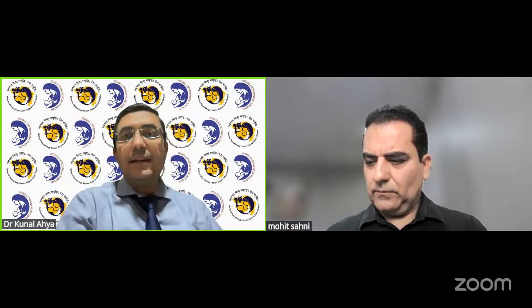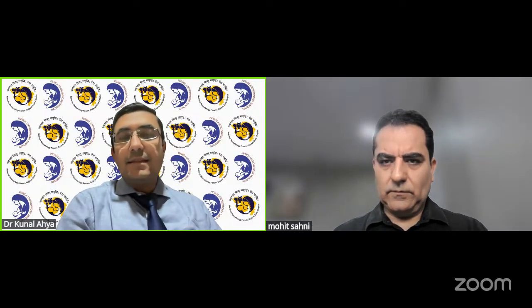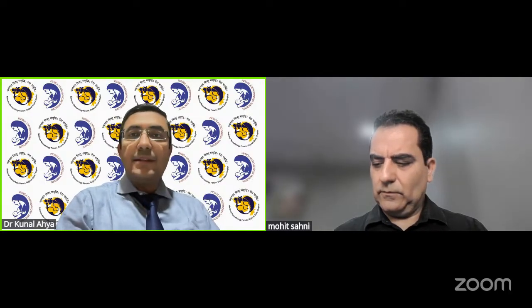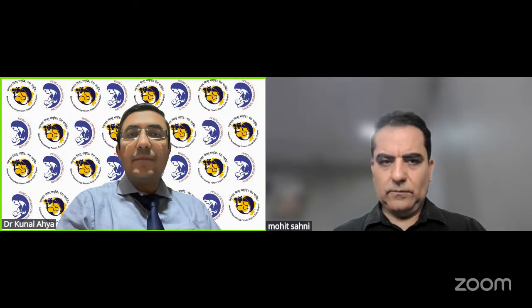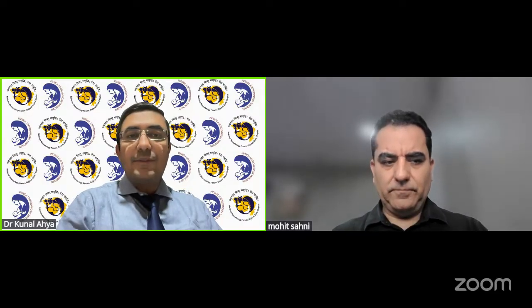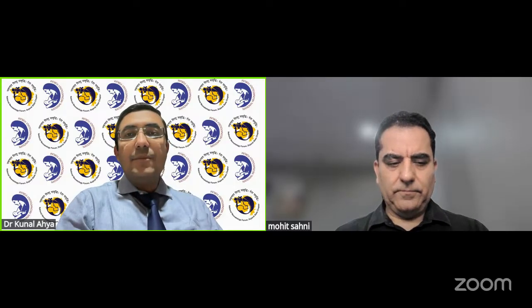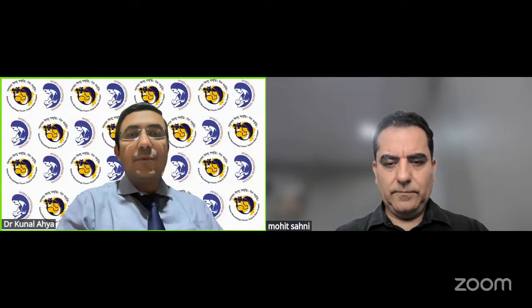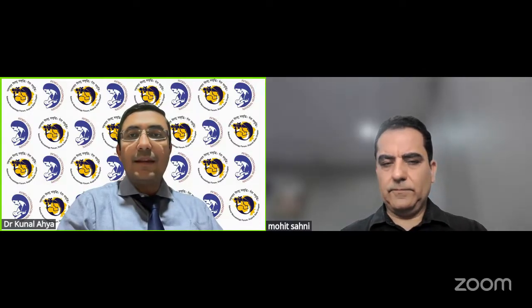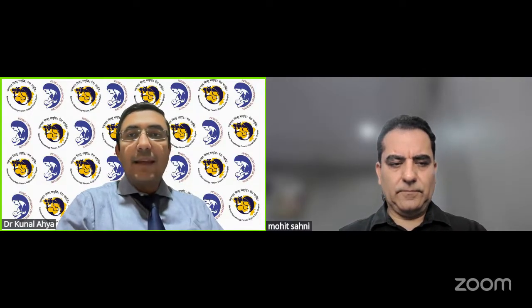And it is a very interesting topic, as we all sometimes are confused where the tip is, and we tend to do an X-ray, but better would be an ultrasound, so it can be a live procedure, and while doing the procedure we can also adjust the tip position. So it is a very important topic which we are going to cover today. I'm very eager to hear from you, sir. Over to you, sir.